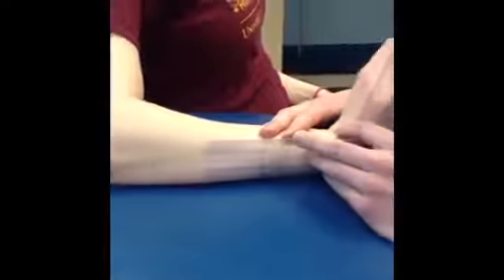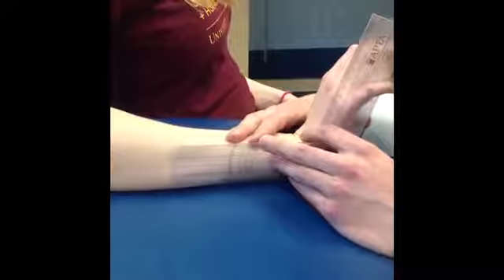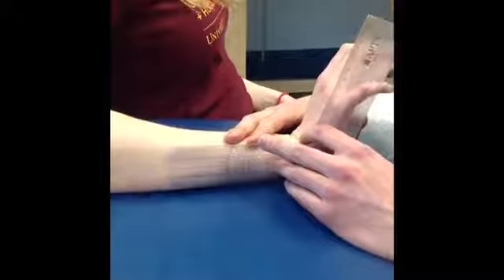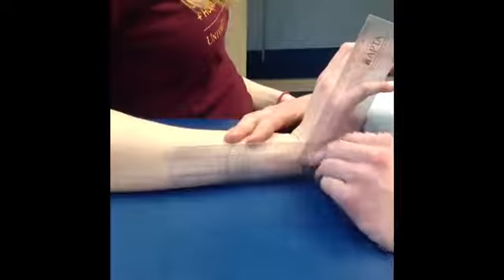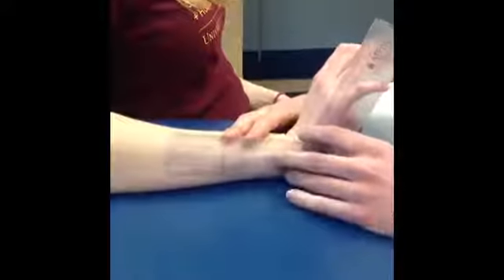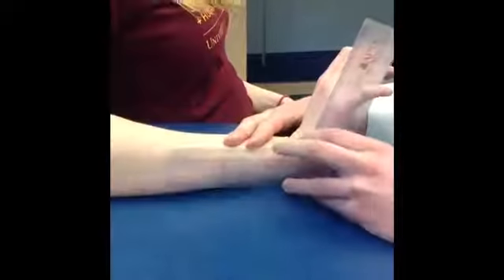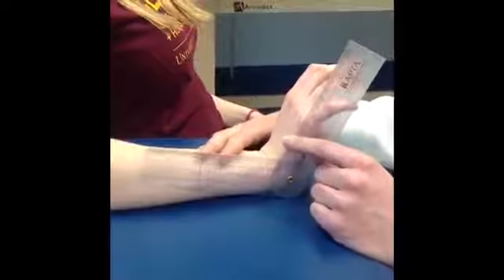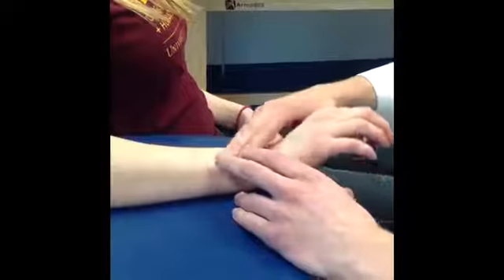My fulcrum's lined up right over the triquetrum. And as you can see, I'm lined up right with the shaft of her ulna. And so I can see from here that she does have right at 70 degrees. It's right on the money there. And you confirm. Usually you don't want to plaster the goniometer on because you might be corrupting your results if you did that. But for this instance, I'm just moving my hand out of the way just so the video can demonstrate the reading.